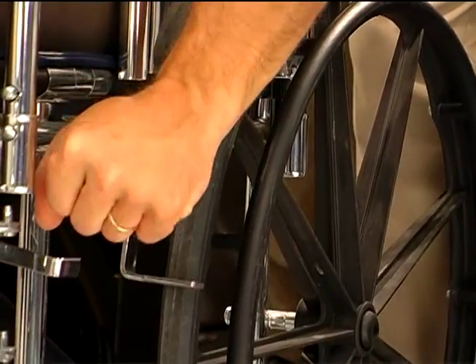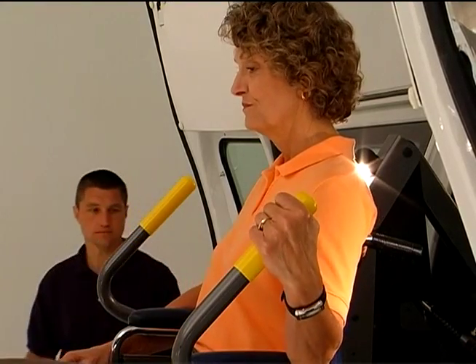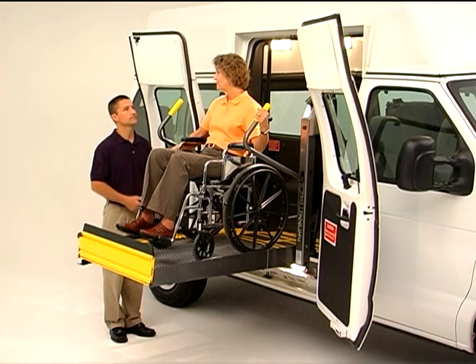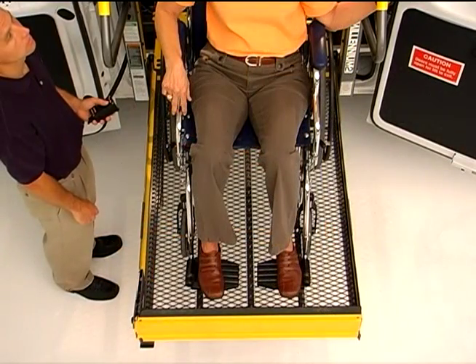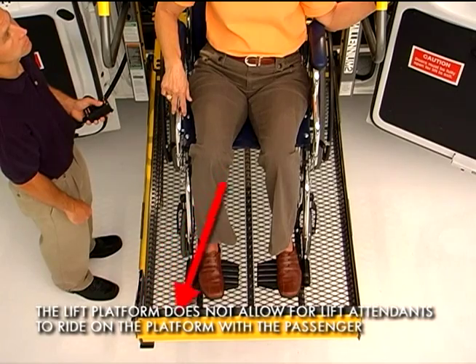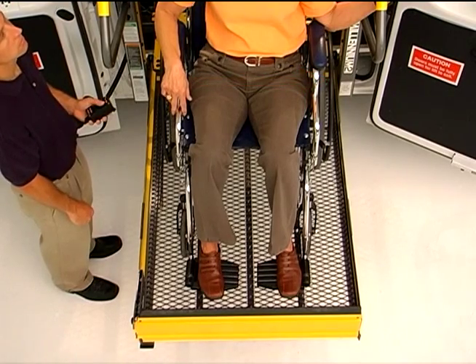Once fully boarded, engage the wheelchair brakes, turn power off to powered wheelchairs, and ask the passenger to hold the handrails if possible. Note that the Millennium lift can accommodate passengers who prefer to face inward; however, Braun recommends the outward position because of the enhanced sense of security it provides for passengers. The Millennium can also accommodate passengers who use walkers or canes or cannot navigate steps into the vehicle. In all cases, it is critical that passengers, whether sitting or standing, are positioned at the center of the platform within the yellow boundaries, to help ensure that they have cleared the vehicle bridge and are in the proper position for side-to-side load balance and smooth movement of the platform.